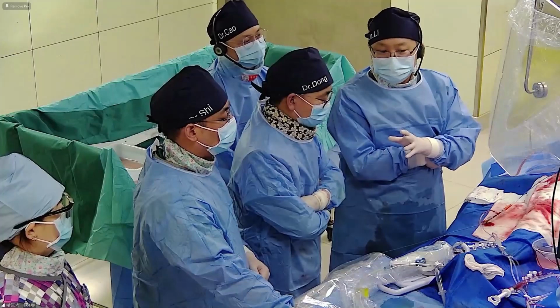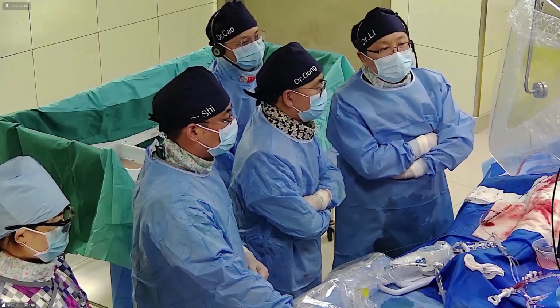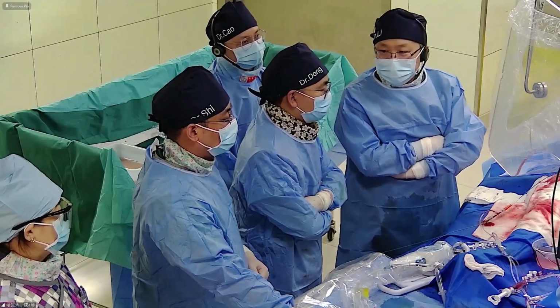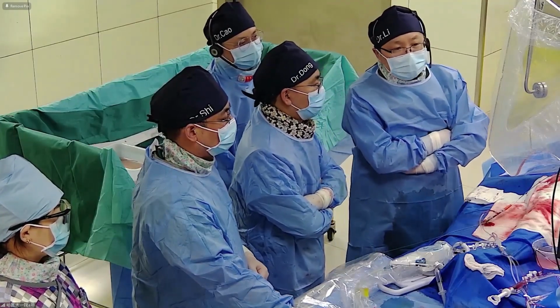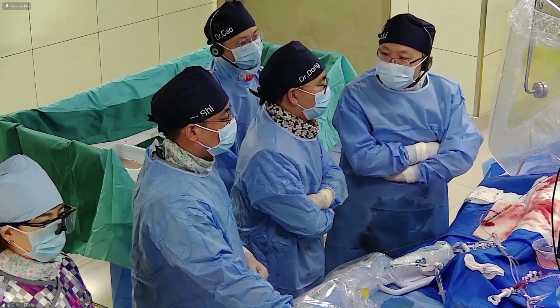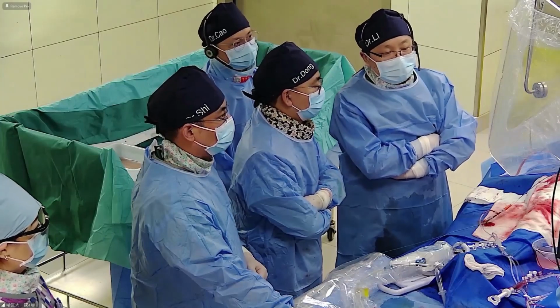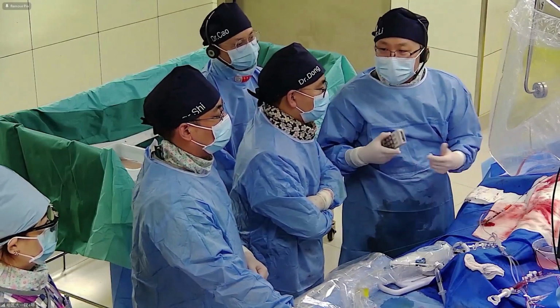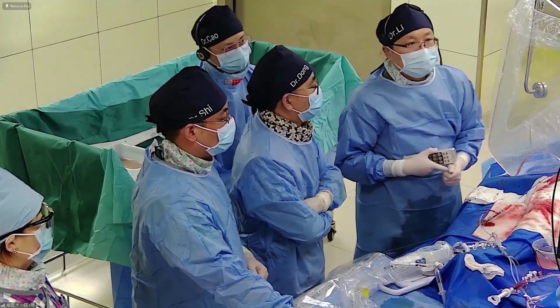In the second PCI, the proximal RCA is total occlusion, with no stent. During the second PCI, they failed to recanalize the RCA CTO lesion. Certainly, the operator made a mistake and didn't use dual angiography.